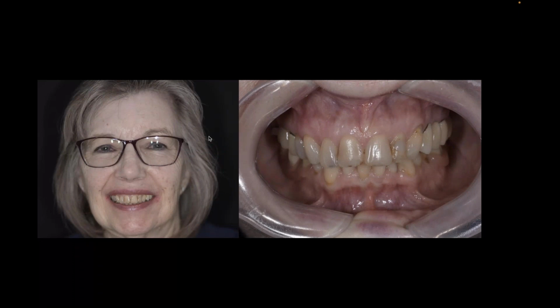We'll try to balance that by getting that little extra 0.5 out of the incisal edge, but we want to make sure that we're not creating this huge kind of Bugs Bunny look on him as we work through the process in the case. So this case will be starting, and I don't think it'll be done. It won't be done for Chicago for sure. This will probably be another 3-4 month process, but it's going to be a nice case. So you guys will probably see it more towards the end of the year.